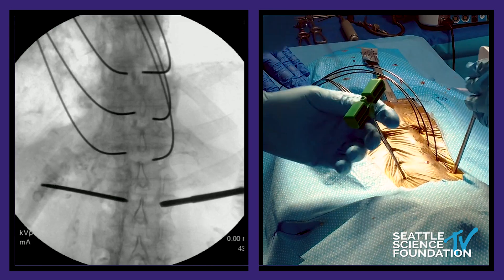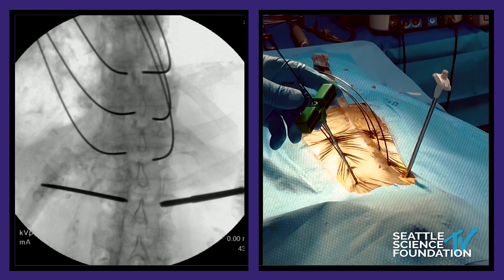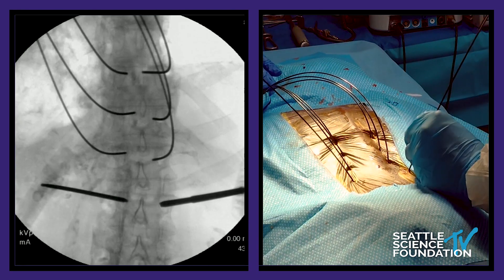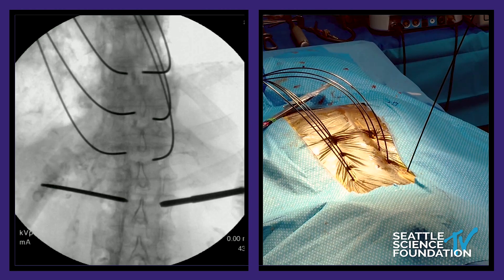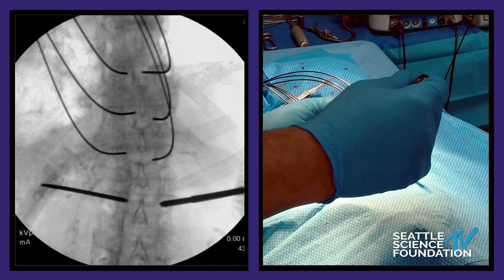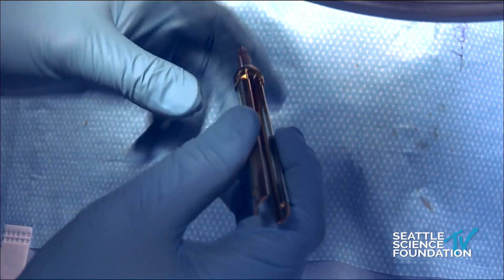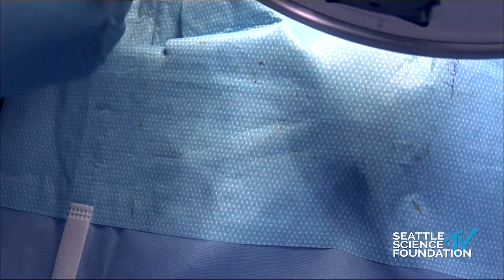We're going to show you quickly how you can put a four-level construct together. This system is very nice in that it's got reduction tabs on there — this is made by the very nice company called SpineArt. These reduction tabs allow you to put them in, and then you're able to put your rod in, put the set screw in, and then pop them off later.